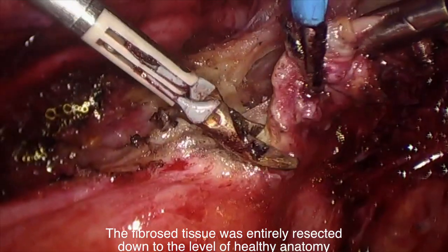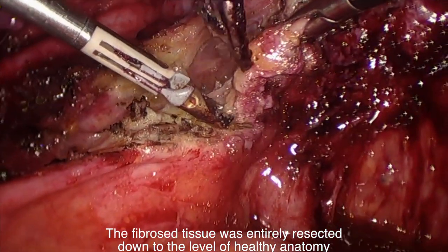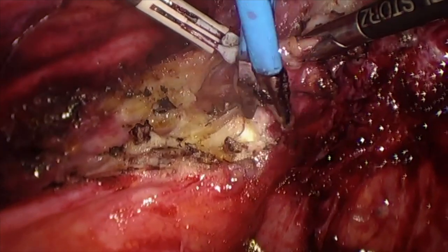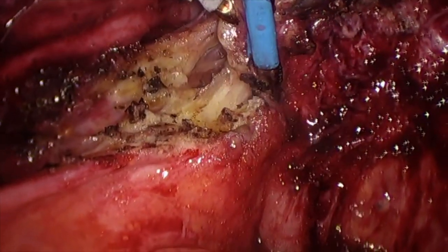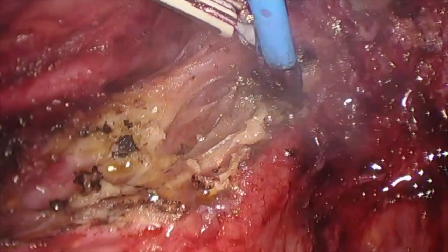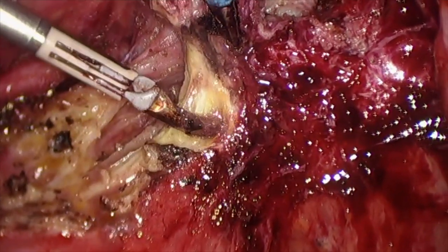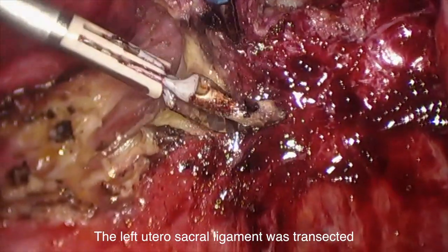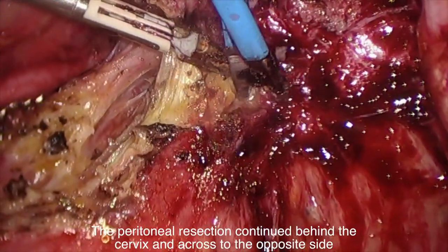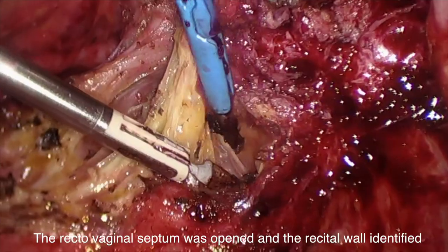The fibrous tissue was entirely resected down to the level of healthy anatomy. The left utero-sacral ligament was transected. The peritoneal resection continued behind the cervix and across to the opposite side. The rectovaginal septum was opened and the rectal wall identified.